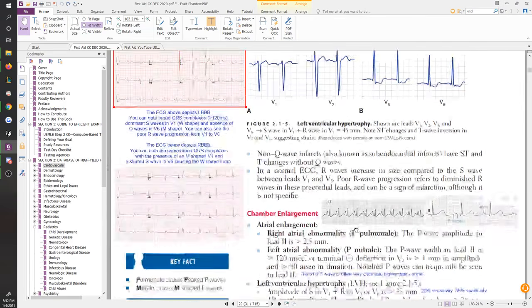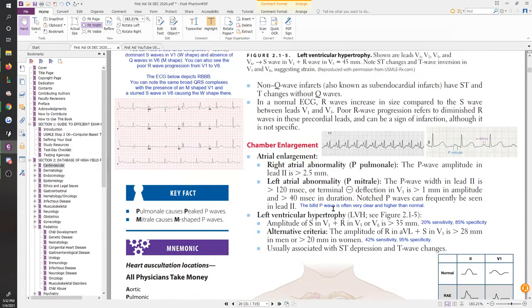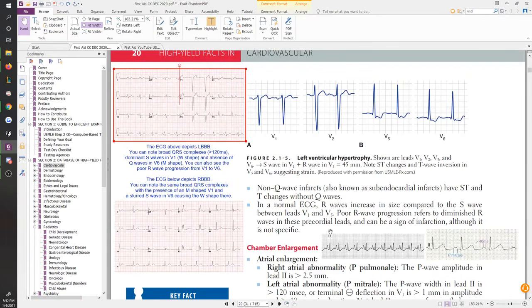The other thing is more things you can look for on an ECG, right? So now the next mnemonic comes up: topics related to chamber enlargement. Okay, so let's jump right into the examples because you can read this on your own whenever you need to, but it's most important to grasp what you see in the leads, right? So let's see the leads they show you in the book.